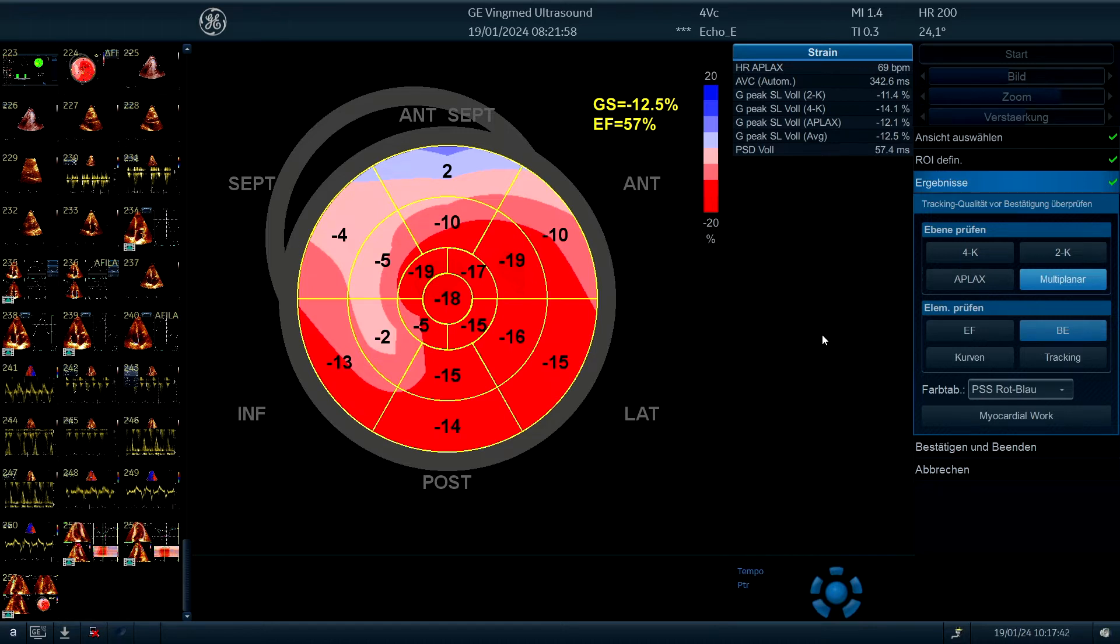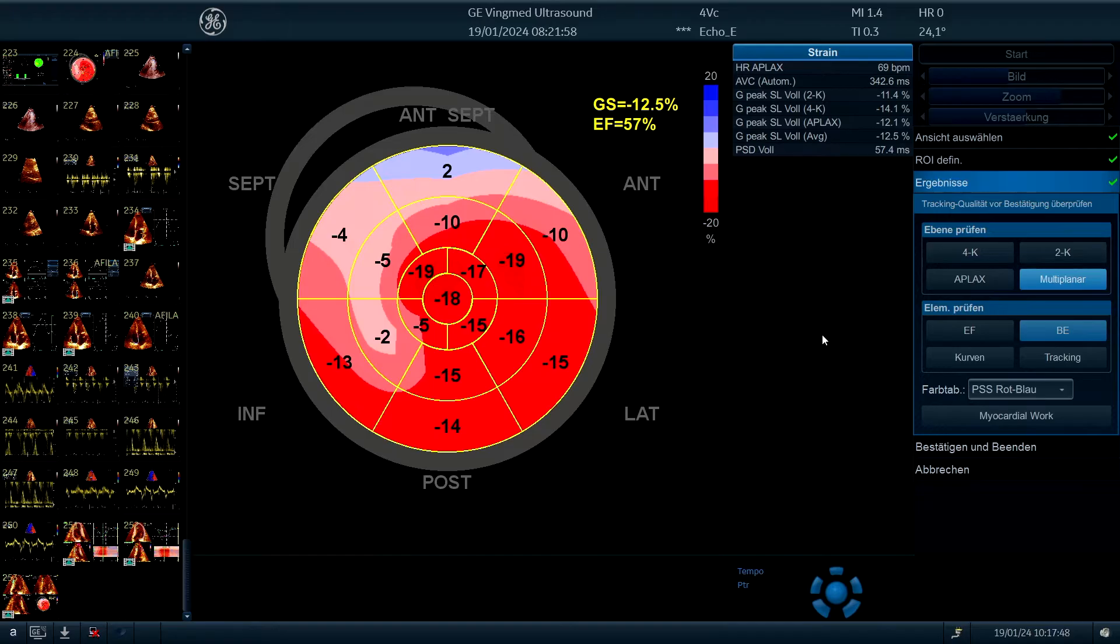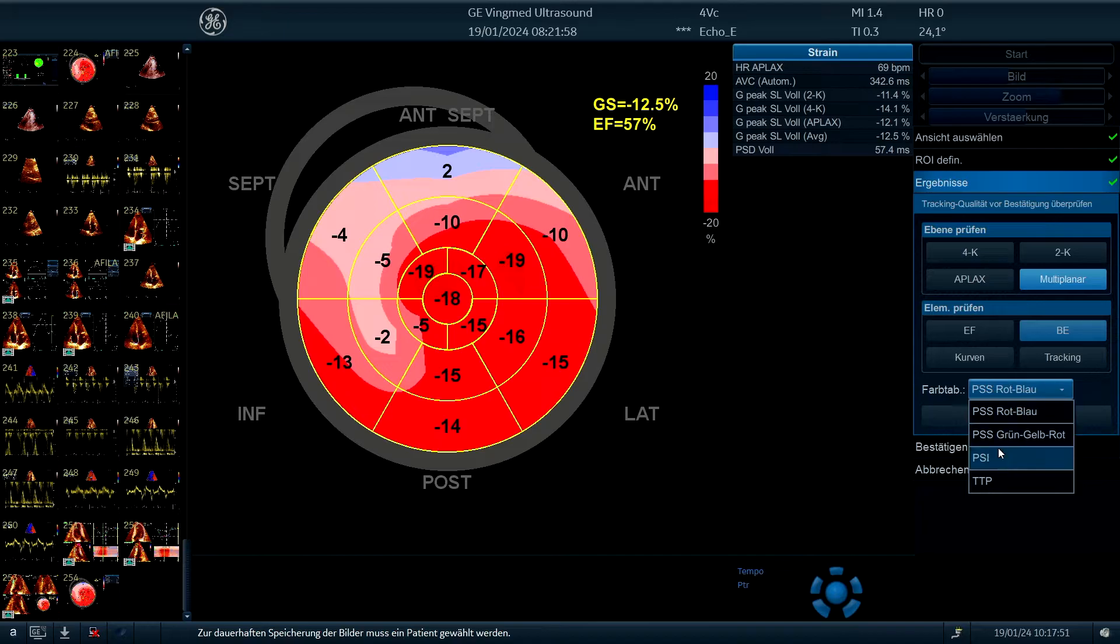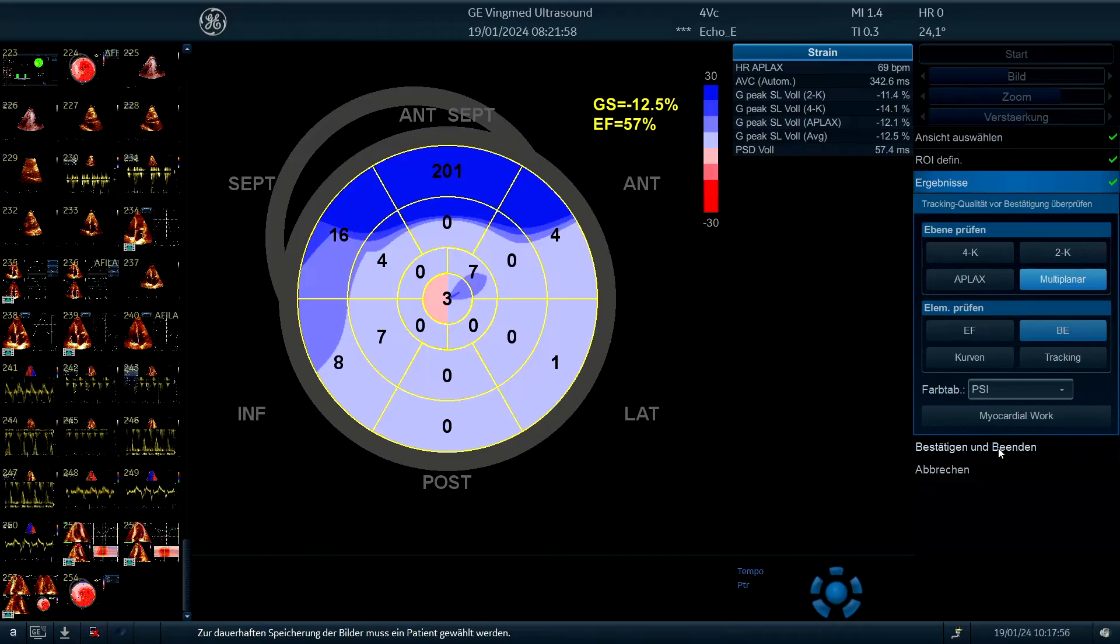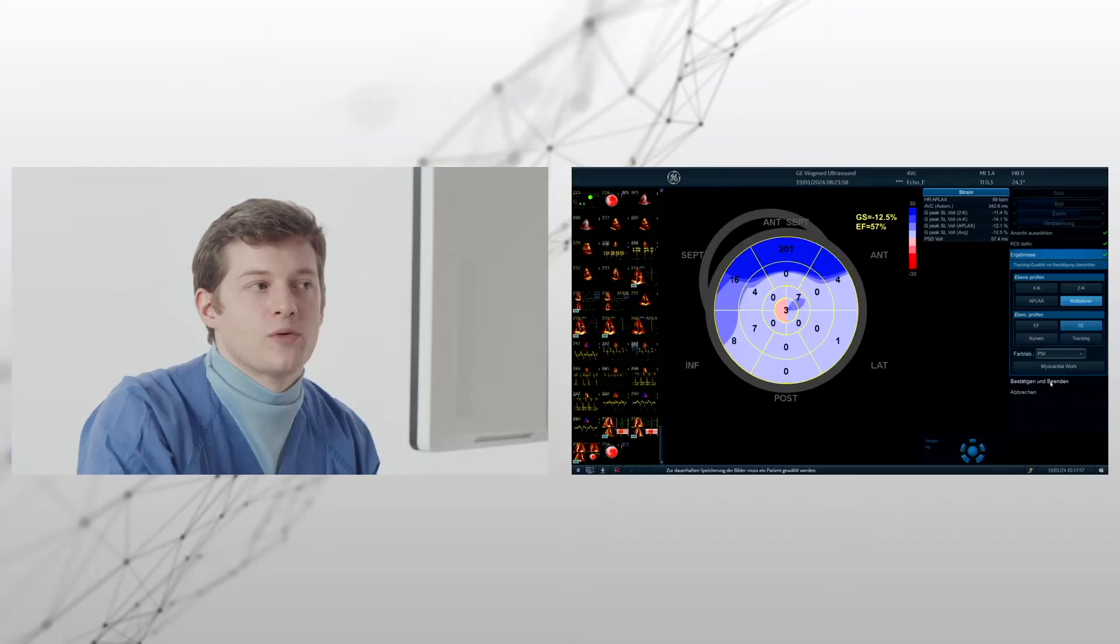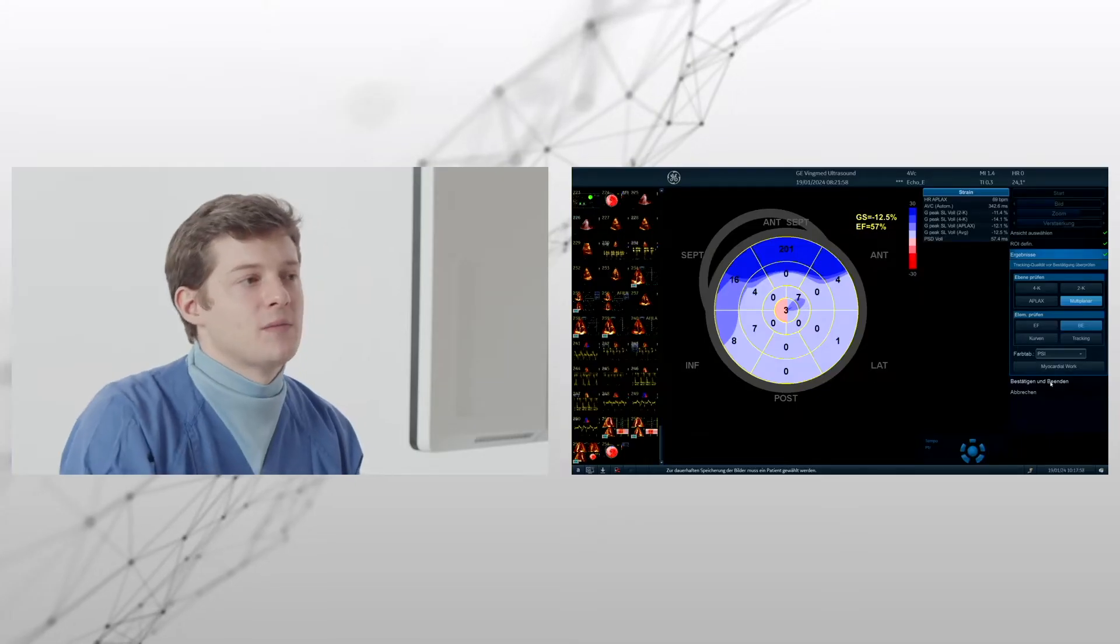So it's gradually continuing to be better. We started around minus 10%, so it's definitely improved. And we also saved this image. So normal is around minus 20, so we are still far away from normal, but it's progressing to be better and better.